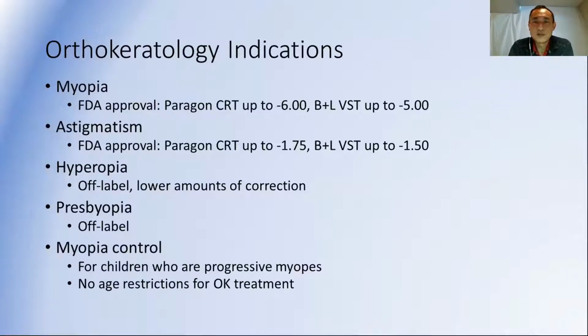It really has to be something that the child is going into knowing what the procedure is about and what their experience will be. So, I fit children, like I said, as young as 6. I usually start around age 8. Sometimes I will put it off if the child doesn't seem ready or really does not want to proceed with the procedure.